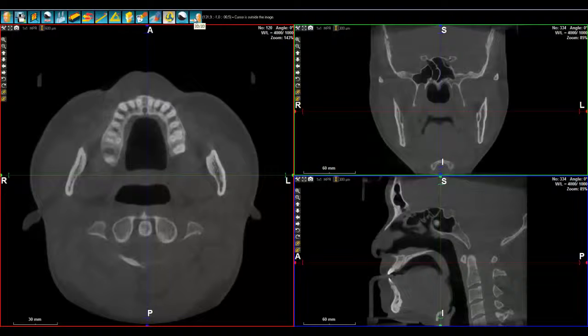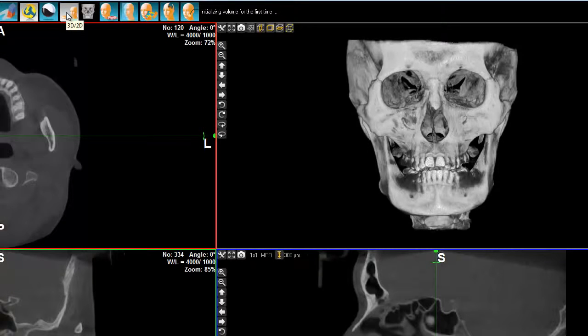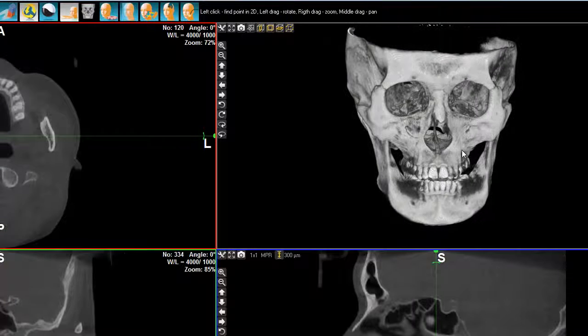There is one application that we can see, which is the application of sinus lift. In a sinus lift, you need to have a certain quantity of biomaterial, and it's always nice to know beforehand what the volume of this biomaterial is that you are going to need. So here, I must say, this is where the function of 3D is quite useful.